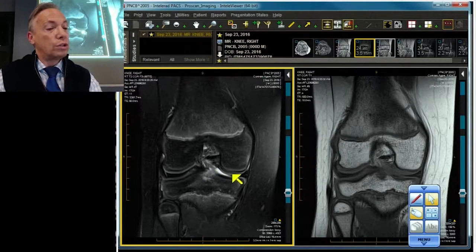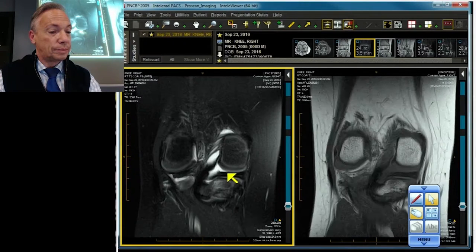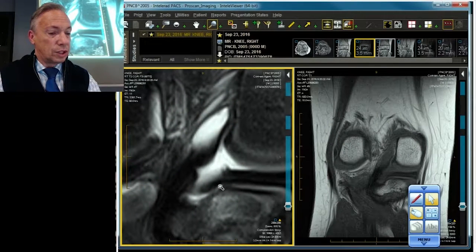Let's go to the medial meniscus. There's our medial meniscus posterior horn. And there is our root ligament, but it does not attach to the bone. That's cortical bone. That's the root ligament. There is a little space between the two. Don't believe it? Let's blow it up. There's a little space between the two.